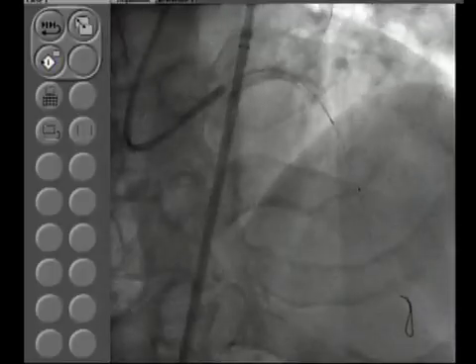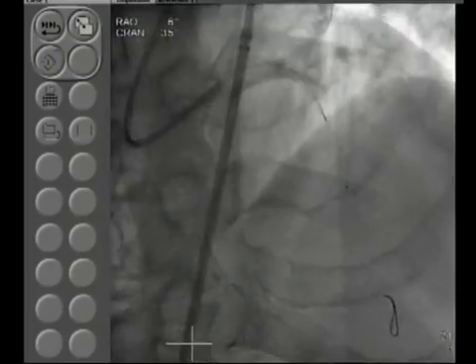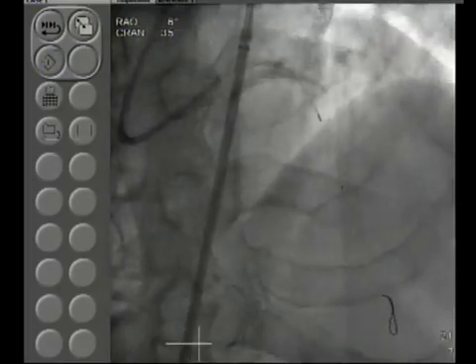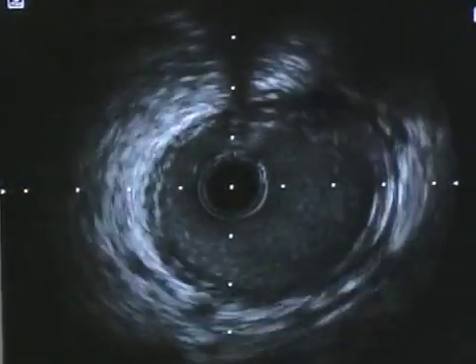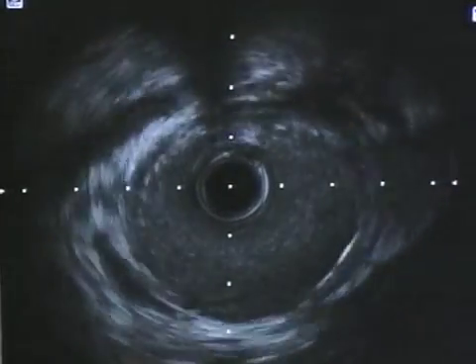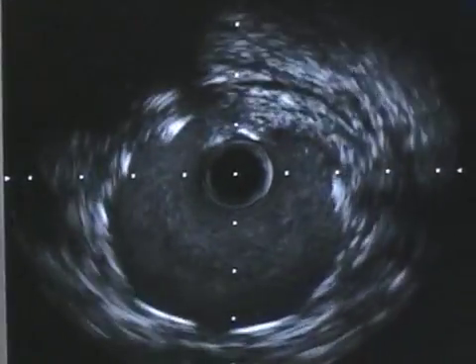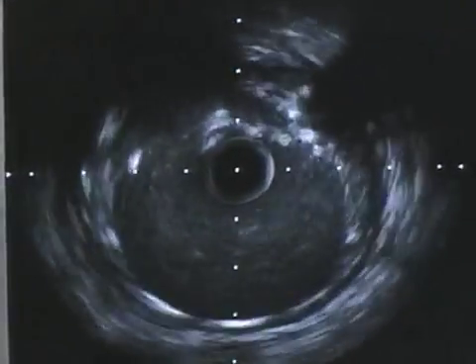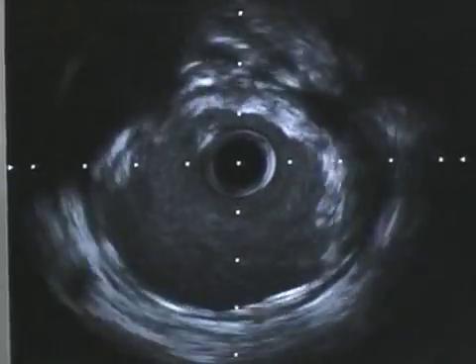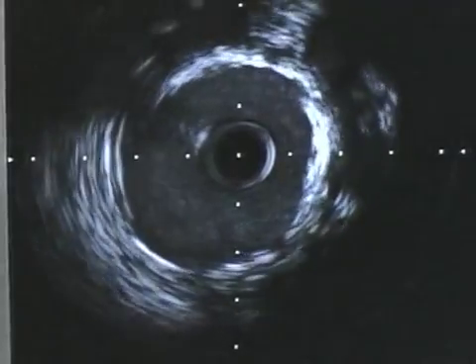We show the IVUS now? Yeah, go. We can make the camera on the IVUS side, change the screen. Yep. Yeah, see these pictures we are calibrated to. The OCT is still going to require a little time, but just by looking at this, one can appreciate how dazzling the OCT pictures are, and you can virtually see every stent strut.